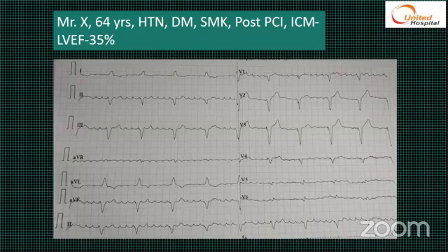Sir, once I have read that the direction of the P wave in case of atrial flutter varies in lead 2 and V1. If it is positive in lead V1, its direction will be negative in lead 2, and vice versa, according to anti-clockwise or clockwise, sir. Here I can see the direction of the P wave is positive. The peak of the P wave is positive in both V1 and lead 2, sir. But here the rate is also very high. So can we say it is atrial flutter here or anything else, sir?